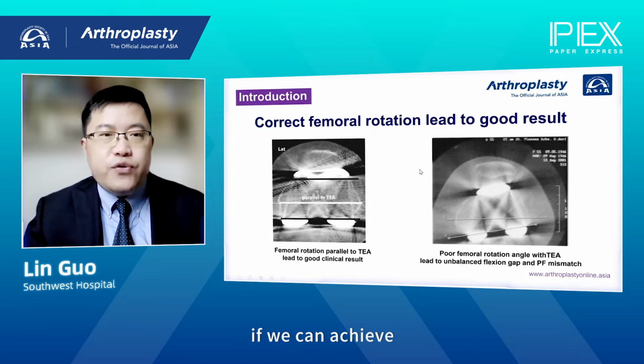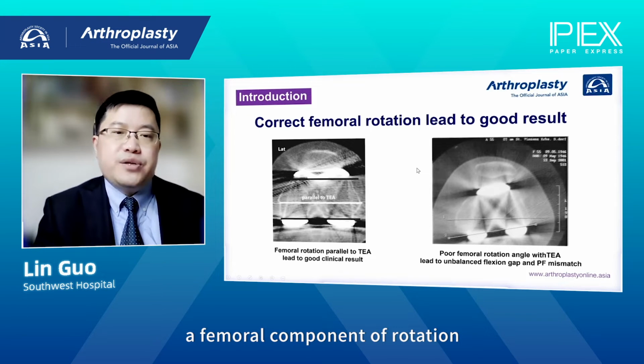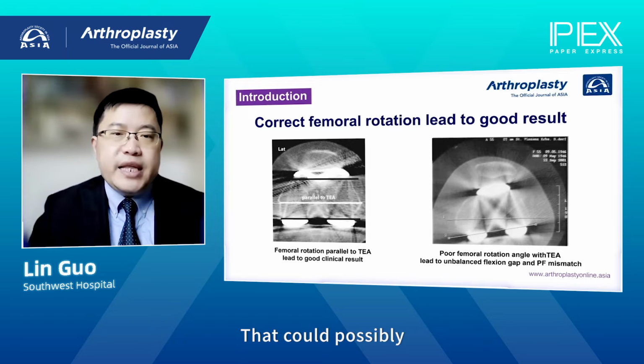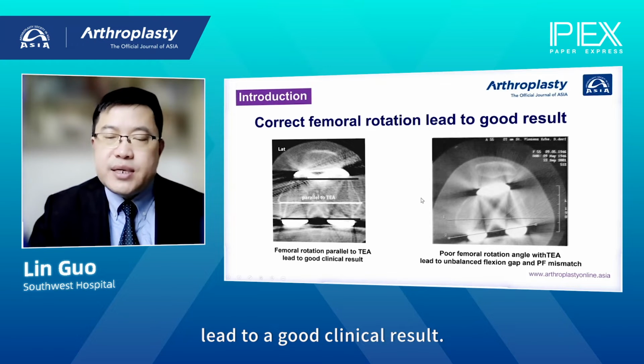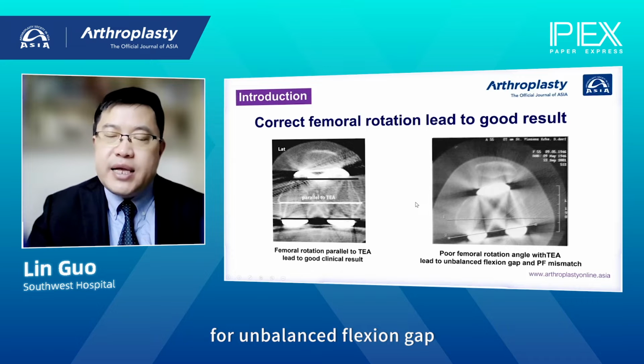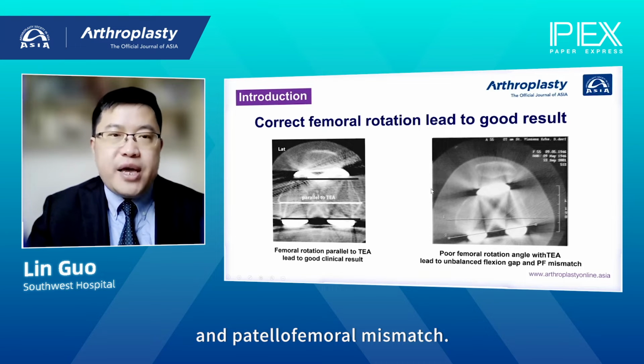During the surgery, if we can achieve a femoral component rotation parallel to the TEA, that could possibly lead to a good clinical result. But if we cannot put the femoral component parallel to the TEA, that could be a reason for unbalanced flexion gap and patellofemoral mismatch.